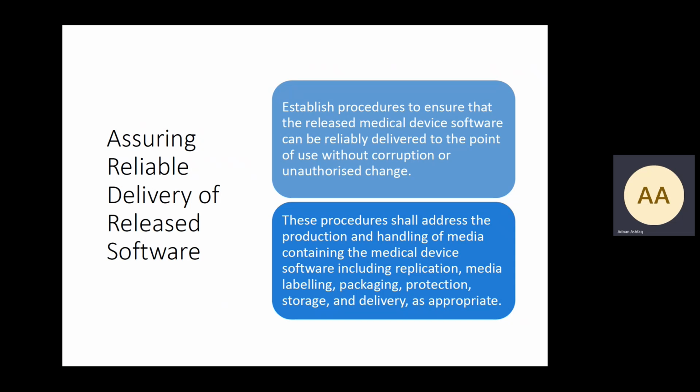Normally, the quality management system that we would implement at Simply Medical would include a package of procedures which would have a software development lifecycle procedure, which is general and very detailed, but then also a separate procedure for various other elements that we're describing and discussing today, including final acceptance software release.